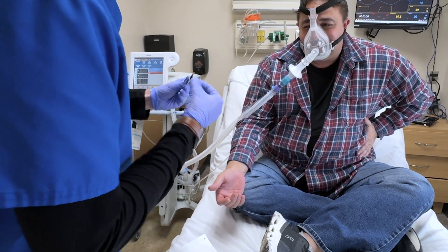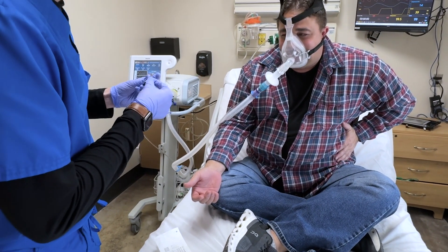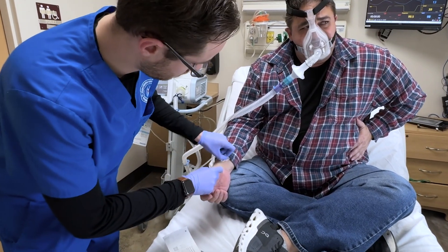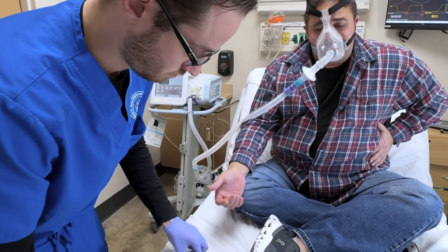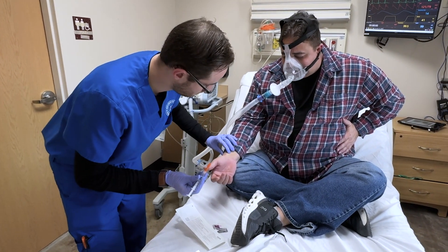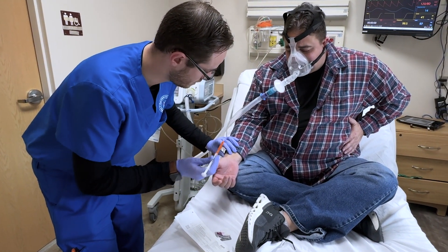I'm going to just wipe a little bit of alcohol. Make sure that you stay still. Alright, try to stay still.